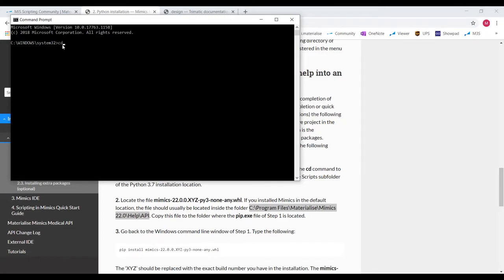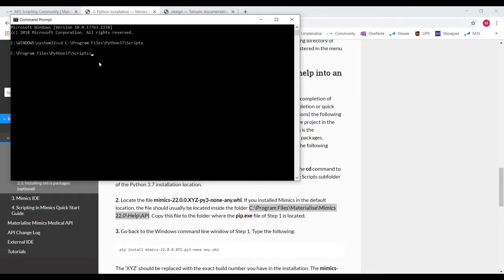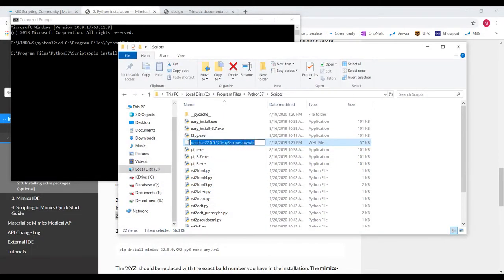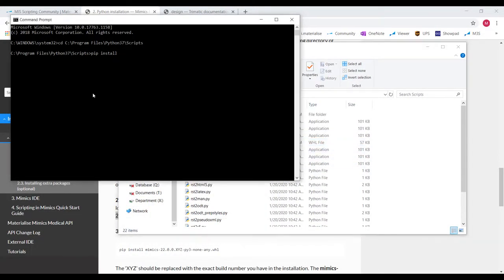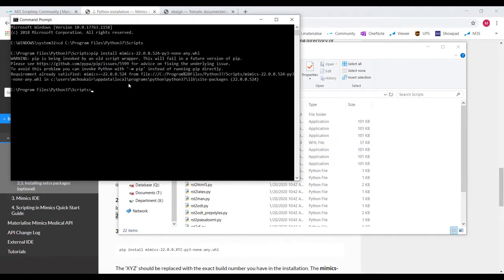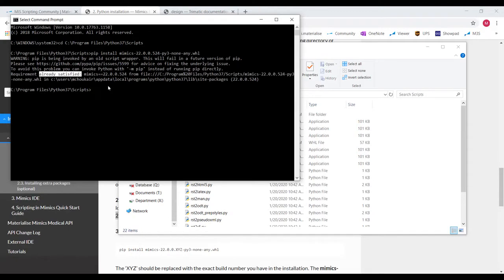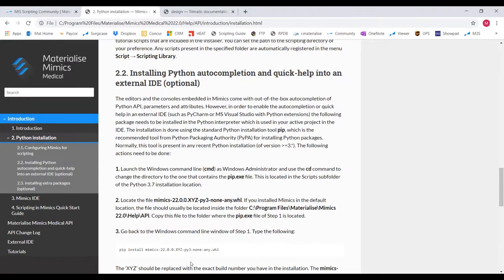To do that, we'll first type cd then copy that folder chain and paste it here and hit enter. Now that our command line has changed to that scripts folder, we can install all the packages we have in that folder. To install packages, we're going to want to type pip install and then the package name. So the first one is that auto-completion file. Let's copy that name and paste it here and then hit enter. I've already imported this so that's why I get this message, but you should get a successfully installed message after it's done loading.